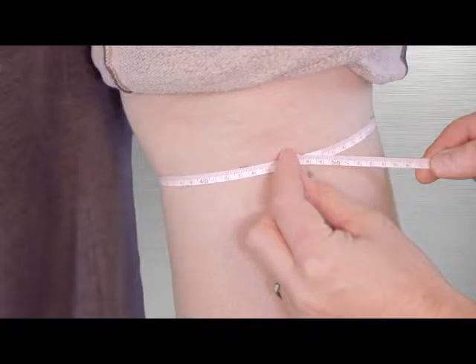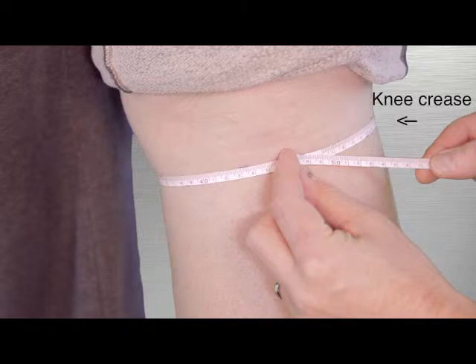In this video we are marking the top right at the knee crease, but you may wish to leave approximately one centimeter between the top of the garment and the knee crease at the back of the leg for patient comfort.